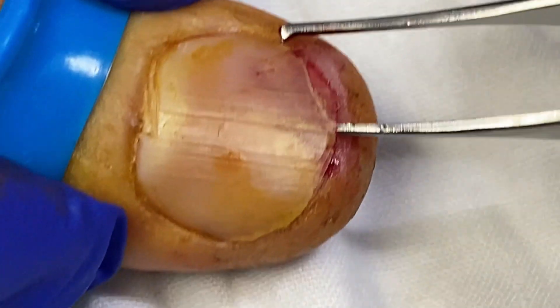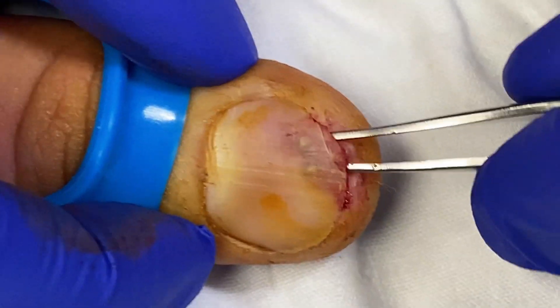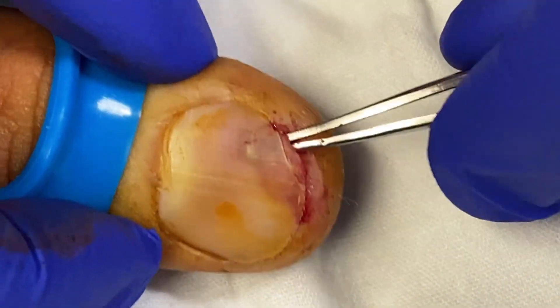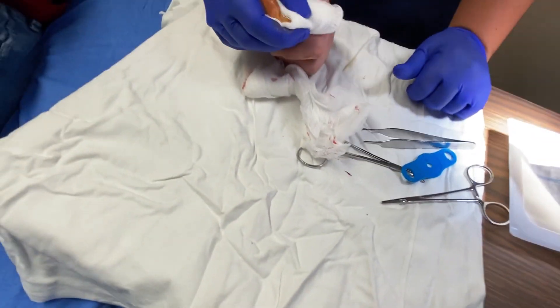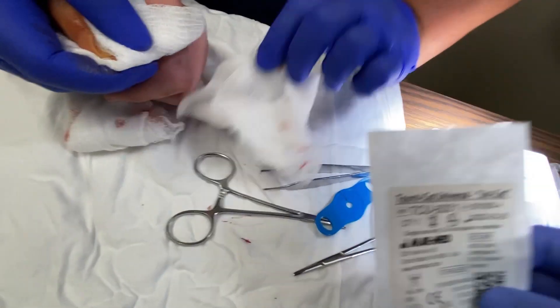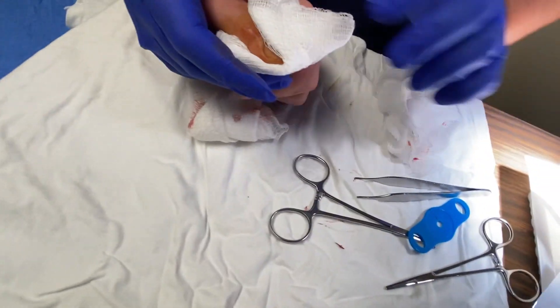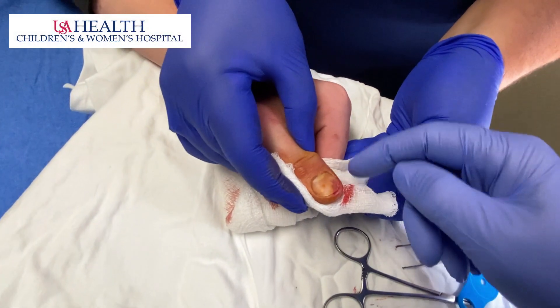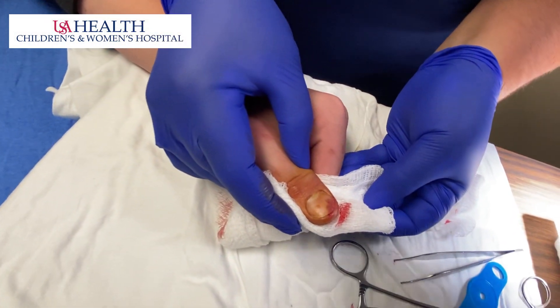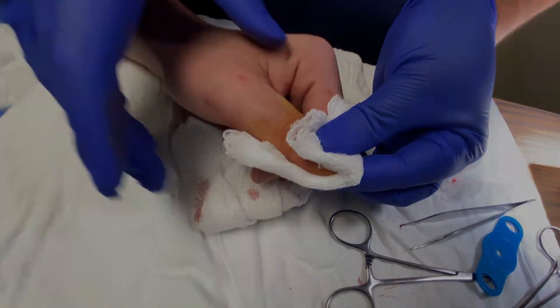I'm going to check one more time to make sure we're clear. Yeah, there's nothing in there. So the teaching points on this: feel free to use a tourniquet — we used the universal tourniquet here. Then you blunt dissect on both sides until you can grab it, and obviously do a good job of anesthesia with a digital block.